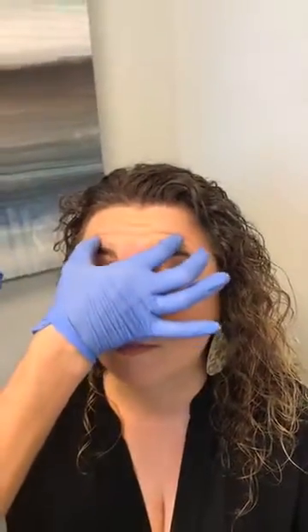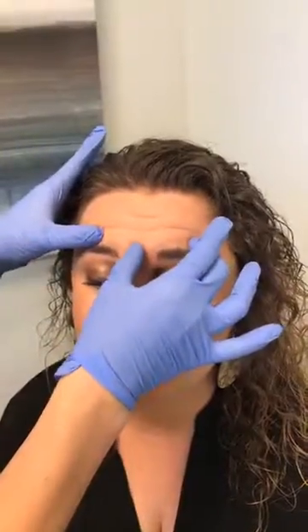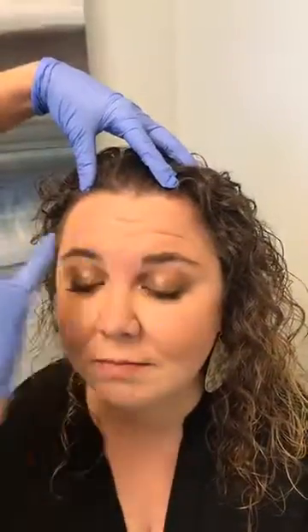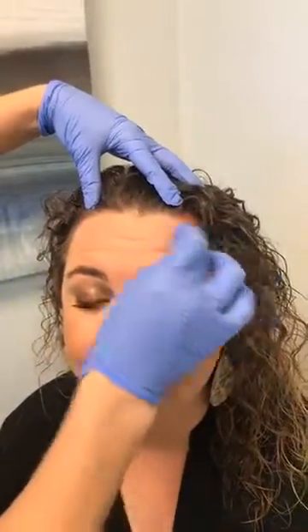Raise up for me. So the forehead lifts. I'm doing the depressor muscles so that these cannot pull down, and then the forehead lifts. So I try to leave a little space here so it can lift, and then I'm going to inject up here. Just to smooth out her forehead. She'll still have expression. Do you have any questions? No. Okay. Okay, so she was talking about a couple of things there about where these injections go.